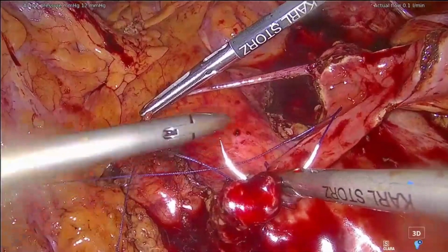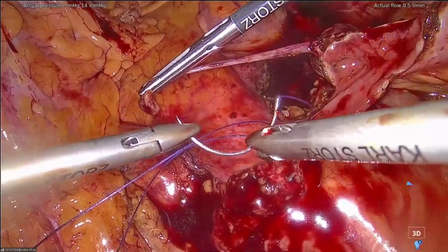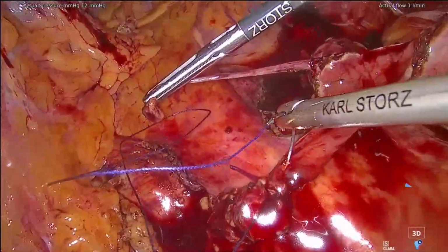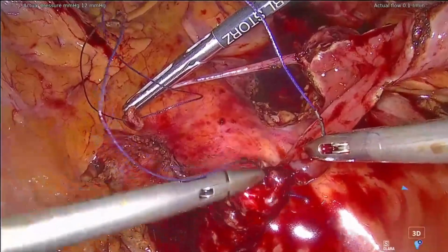Renaud? Yes, sir? You don't use cutting needles. No. I hope that it's not a cutting needle. It doesn't look like it. No, it's a round needle. The round tip needle. It's very important. If you use a triangle needle, you will have a lot of holes. But it's not the suture that I use normally. I prefer a 4-0. But in this case, both sides are already fibrotic. Then it's a really thick tissue. I think that the 3-0 would work also.